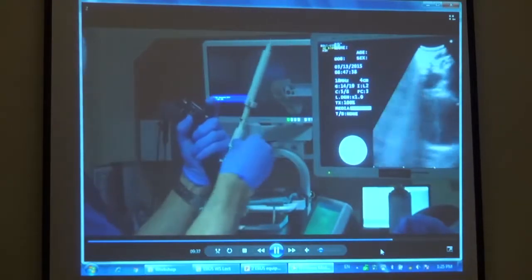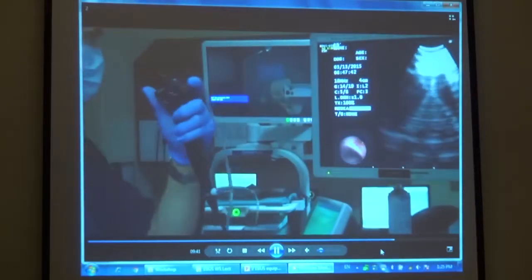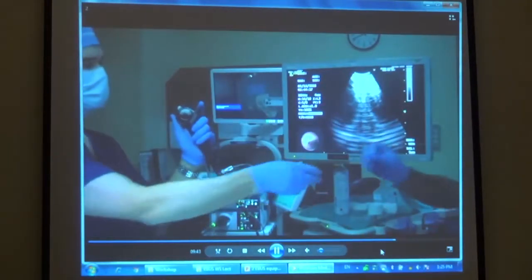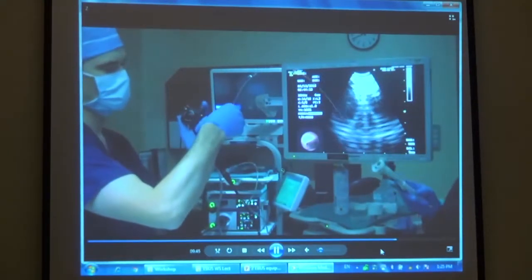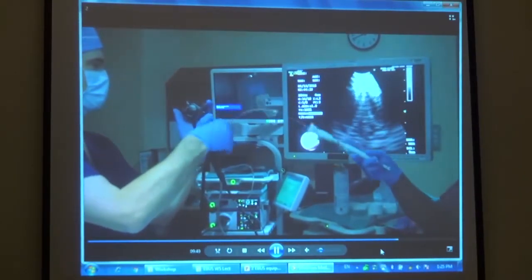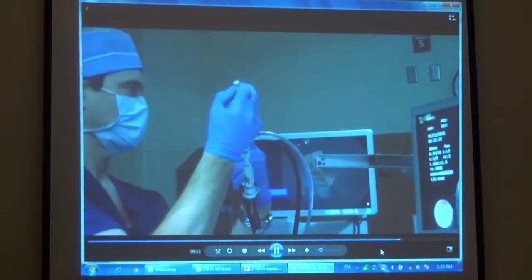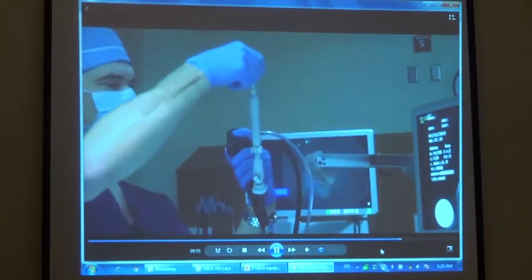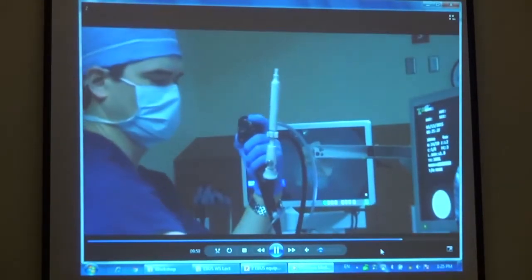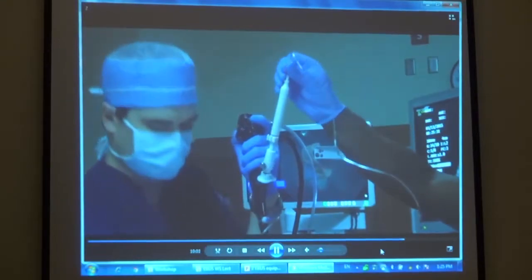Once the aspirate has been obtained, the needle is fully withdrawn back into the sheath, then taken out of the bronchoscope and handed to the assistant. It's often helpful to rotate 2 needles so that one may be used by the operator while the specimen is being removed from the other. At least 3 separate punctures per nodal station are performed. Thus, for a staging procedure where 4 or 5 separate nodal stations may be examined, as many as 12 to 20 punctures will be routinely performed.